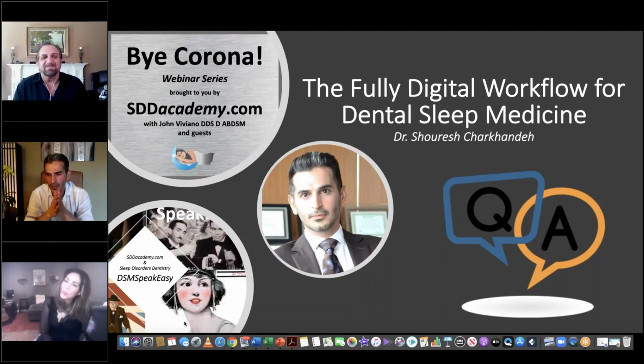You raised a very, very good point. So again, let's go back to the clinical technicalities of it. You can test them at different verticals if you want to, which we talked about with the insert, and you can take your bite at different verticals. The only variable of the bite that we use from Matrix Plus is the AP, so you can still determine where you want to put your patients at the different verticals. If they're a responder at plus one, you can use a plus one at 2 millimeter, 4 millimeter, 8 millimeter vertical, whatever you need. And that's what I choose to do.